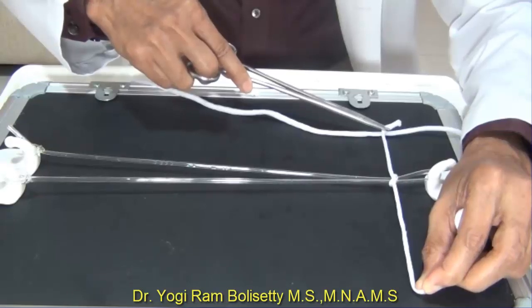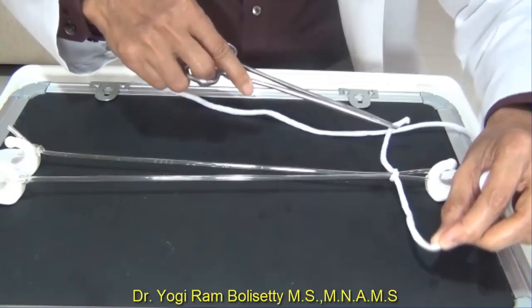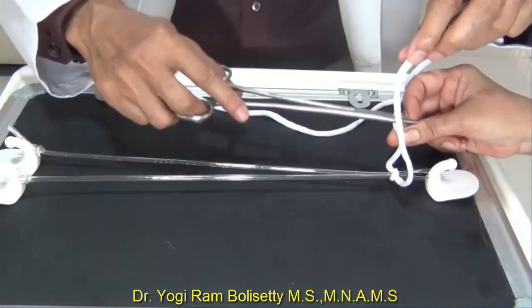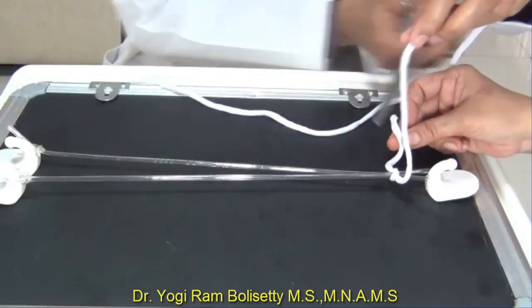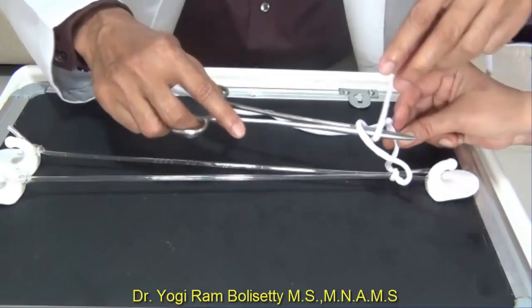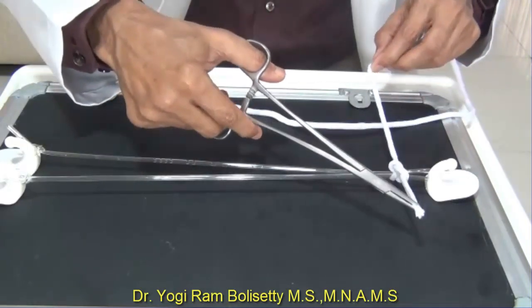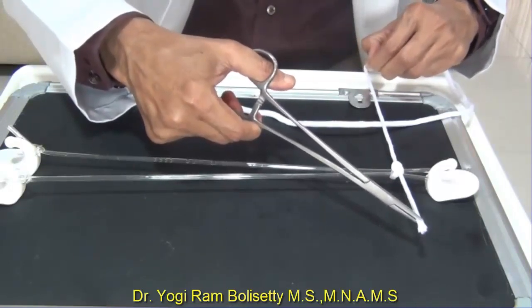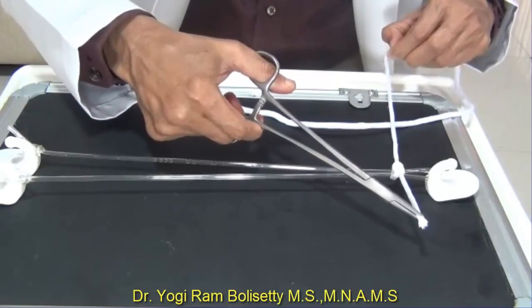A square throw is a secure throw. Now form the second throw. Again, pass the needle holder into the loop from the same direction — not from outside. Turn the long strand around the needle holder, this time in the anti-clockwise direction. So one throw goes clockwise and the next goes anti-clockwise. Pull the strands again in opposite directions at 180 degrees to form a square throw. A square reef knot is now formed.